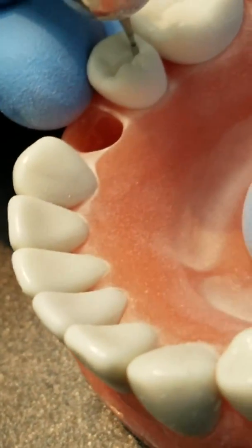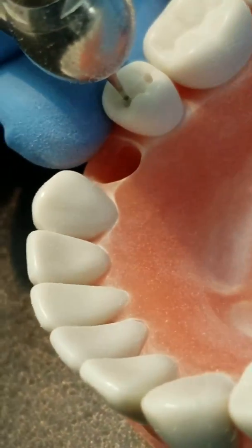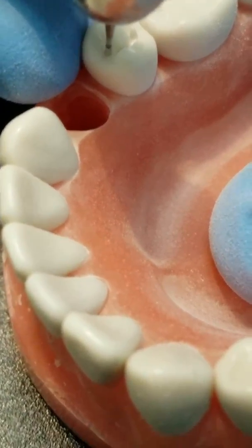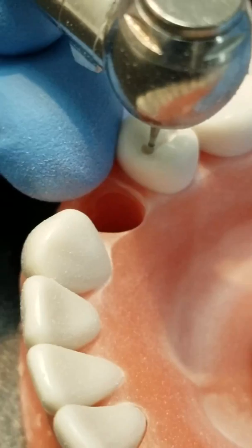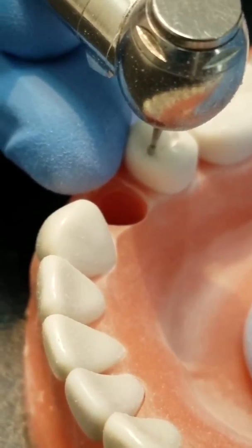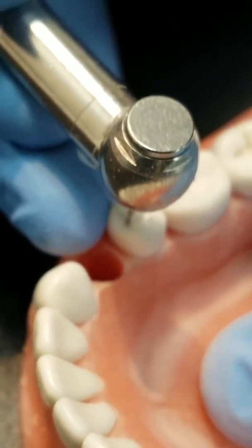Once you get that central groove shape, go ahead and slow down on your pedal and start shaping the rest of the tooth. Get the horns — the facial horns — right at the pit, but slow down on your pedal. That way it's a lot more difficult to mess up.